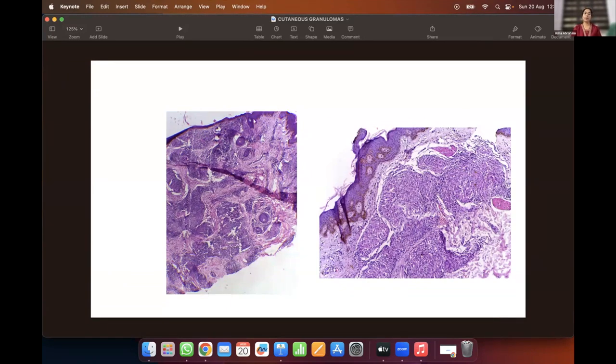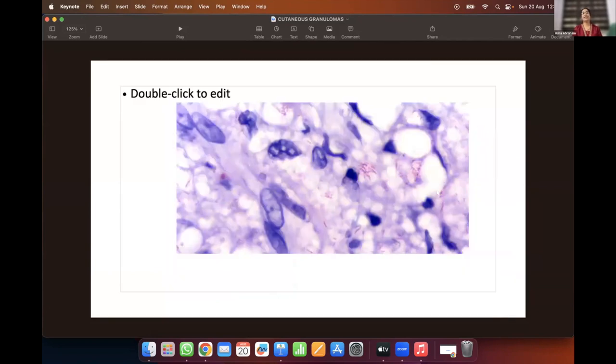dermis. What is peculiar about these granulomas is that they follow the neurovascular bundles. So when they follow it, it gives a curvilinear appearance, which is referred to as serpiginous granulomas. So you can again see that this is a cluster of epithelioid cells and lymphocytes. And if you do a special stain, that is the modified Fite stain, you will see the acid-fast bacilli.